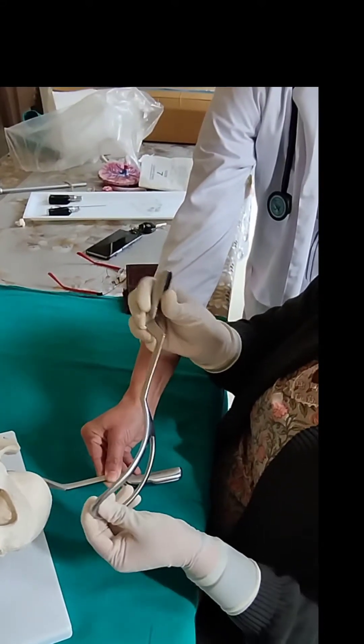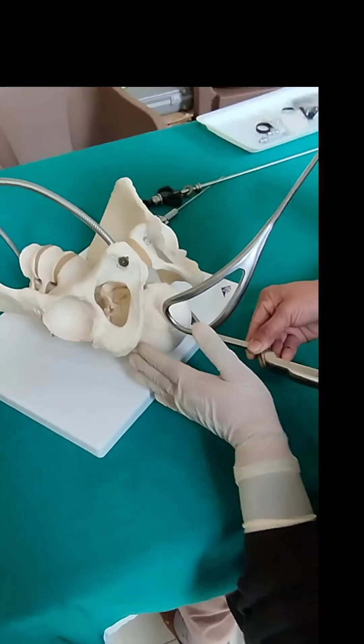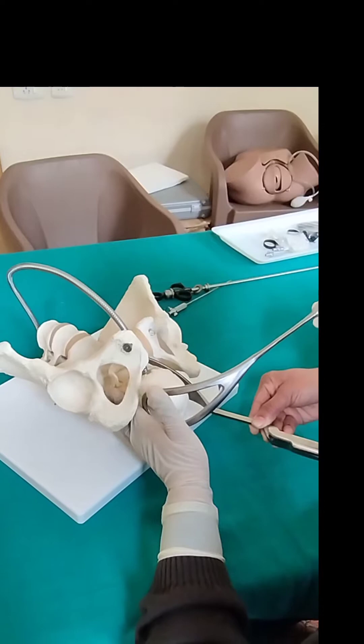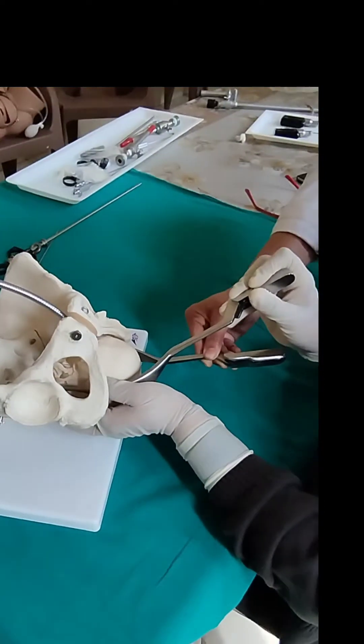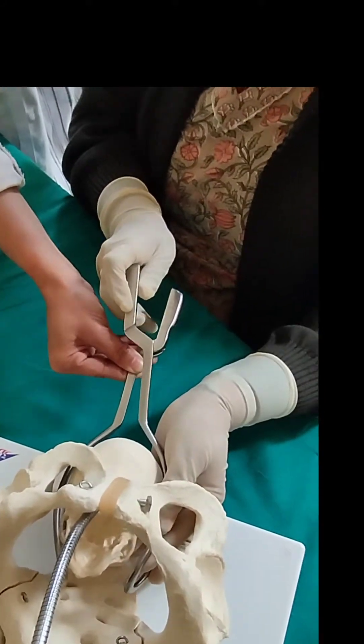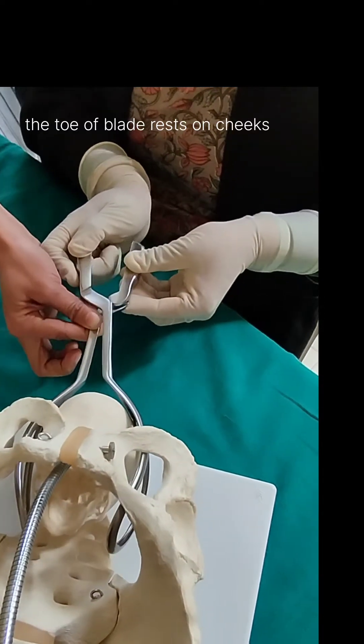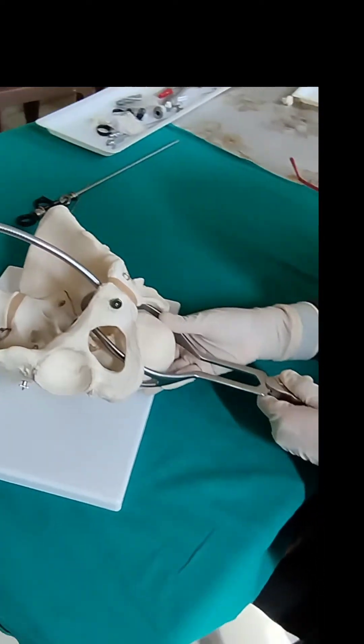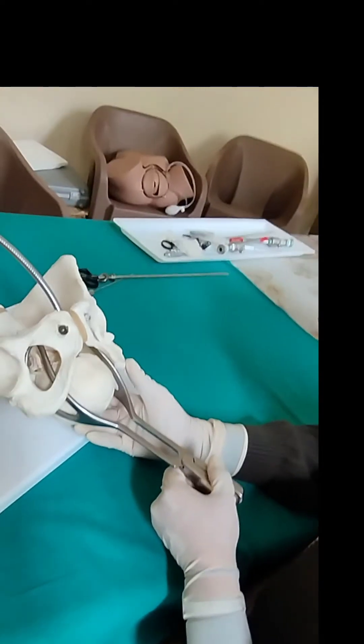Then take the right blade, make it to 45 degrees. Again insert your left hand to act as a guard. Under guidance of your hand, you will insert this blade also. Once it reaches its proper position, you will lower it down and you will try to lock both the blades. This is the way you apply the forceps.